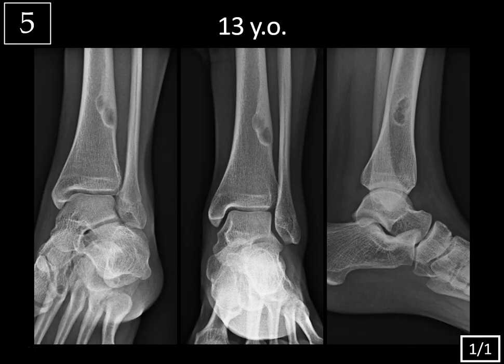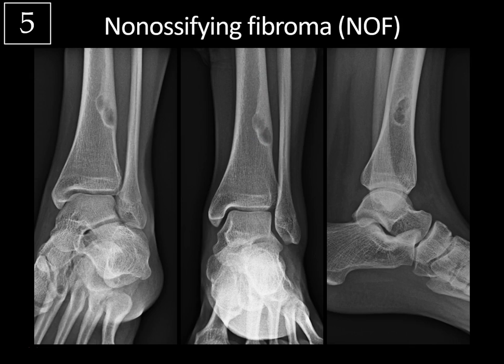Final case — 13-year-old. This is an ankle series in a pediatric patient. You can see the growth plates are open. There is a cortically-based, peripherally sclerotic, eccentric lytic lesion, typical for a non-ossifying fibroma, or NOF. These are very common — the most common fibrous bony lesion in children and adolescents, peaking around age 10 to 15. This is considered a skeletal don't-touch lesion because it has a classic diagnostic appearance and is completely benign. Most require no treatment; if large they can put the patient at risk for a pathologic fracture, but one of this size is of no significance.